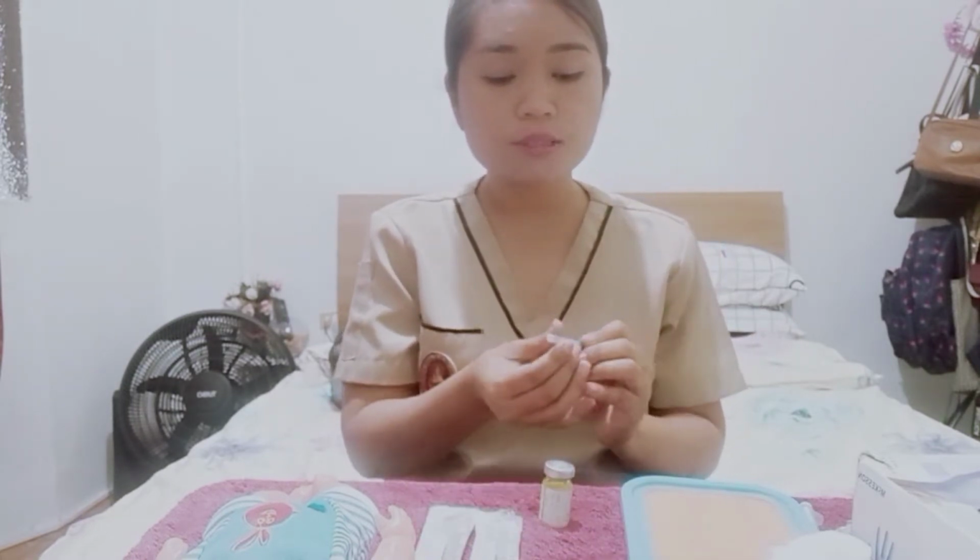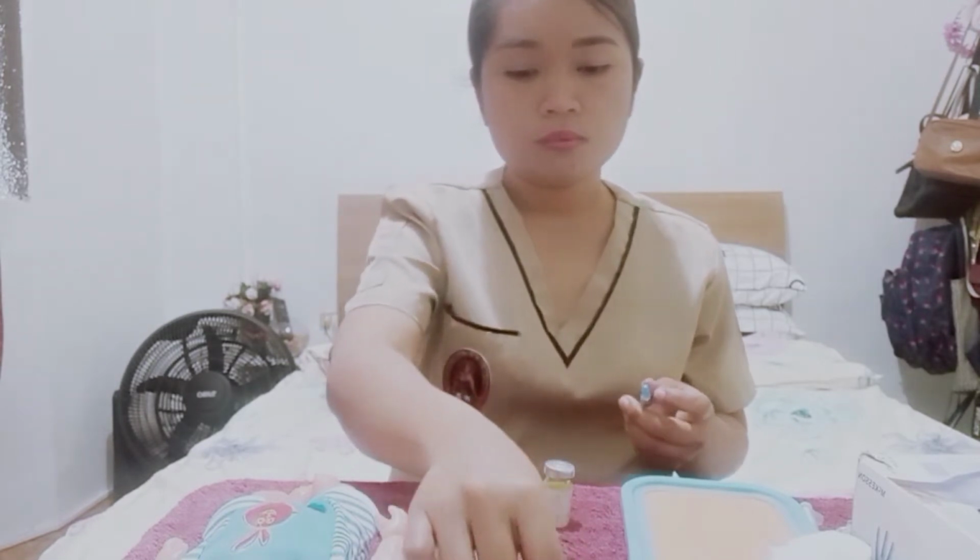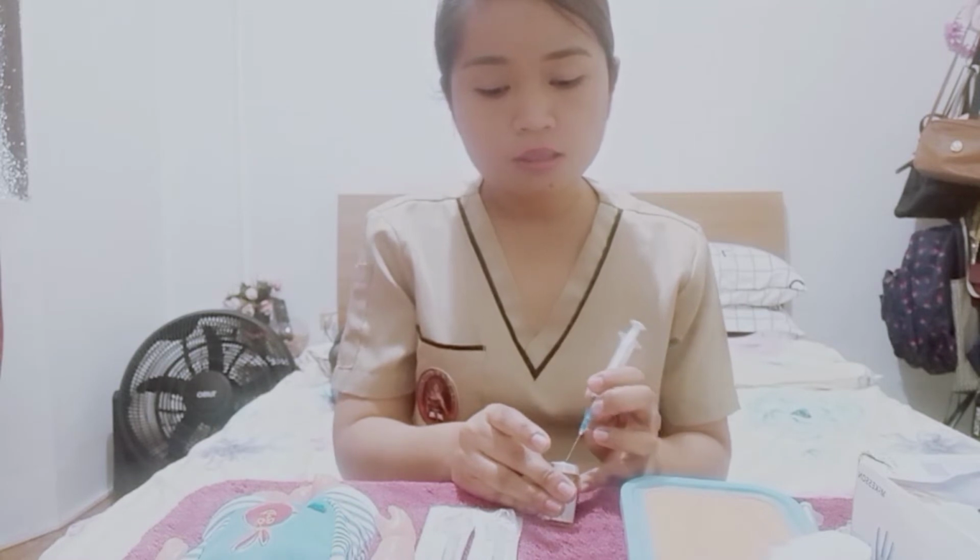And then after that, all we have to do is just to use our 19 gauge syringe to get the medication.